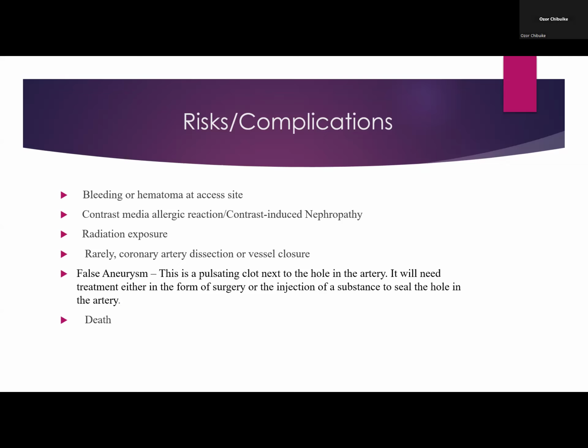Of course, in specialized situations like diabetes and all that, we need to be more careful. Then, as part of the measures to minimize the incidence of contrast reactions, one of the methods adopted is the use of carbon dioxide in angiography. The advantage of that is that it causes lesser contrast reactions, contrast-induced nephropathy.